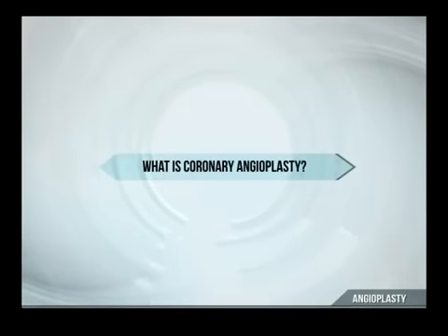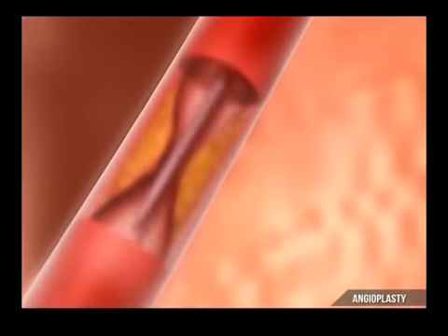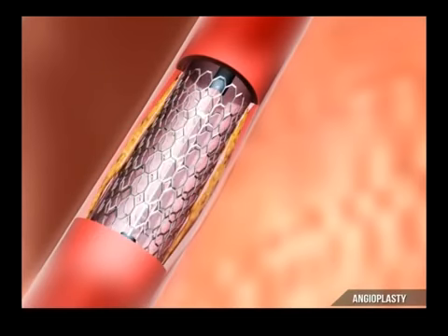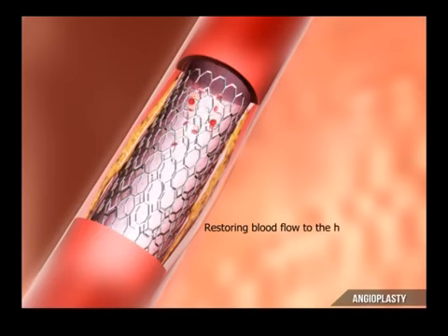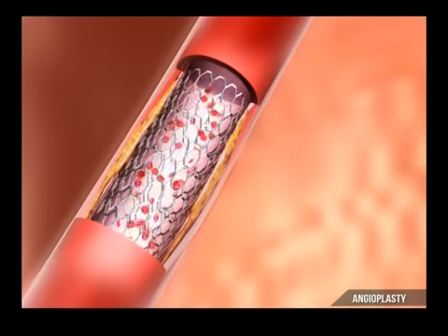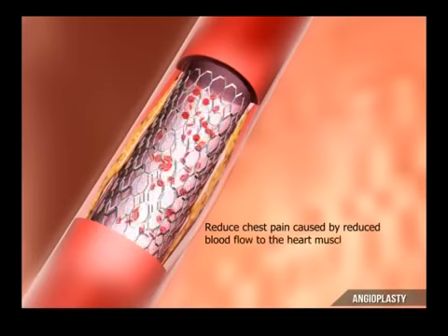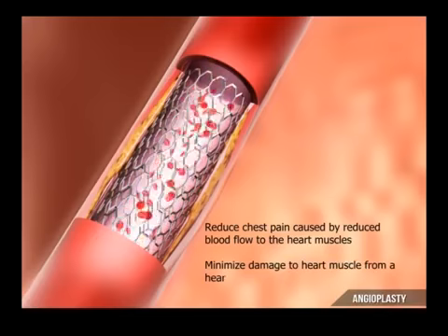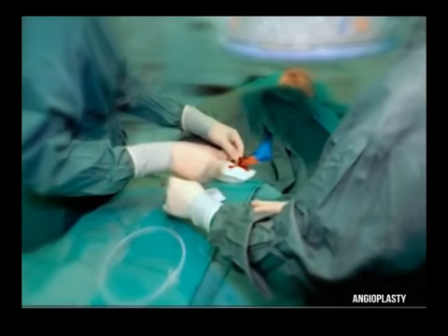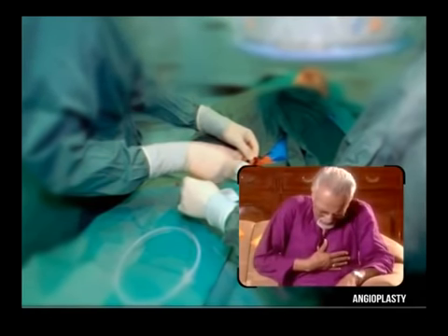What is coronary angioplasty? Coronary angioplasty is a medical procedure which opens up blocked blood vessels, thereby restoring blood flow to the heart's muscles. Coronary angioplasty may be needed to reduce chest pain caused by reduced blood flow to the heart's muscles, and minimize damage to heart muscle from a heart attack. This procedure is sometimes done as an emergency procedure after an angina or heart attack.